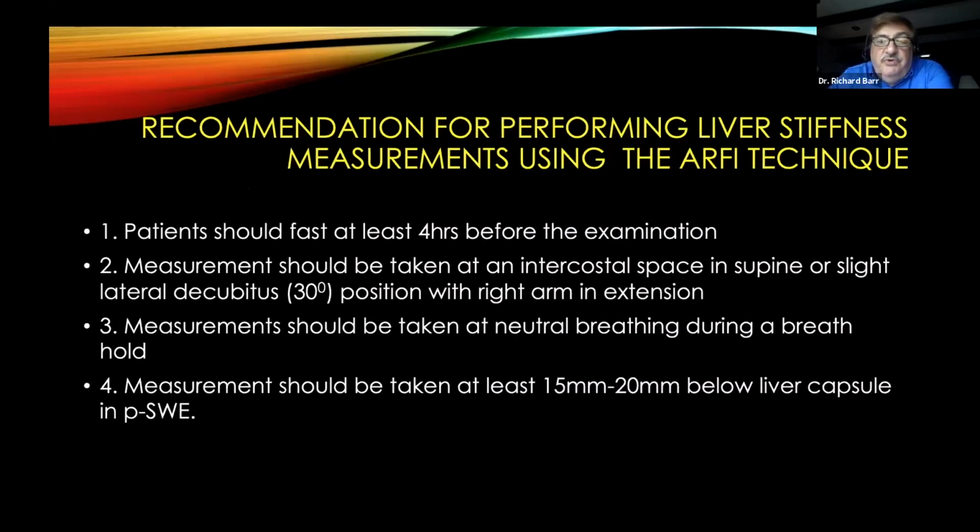Let's just go through the measurements, how to do the measurements, because it's very critical. You have to follow a very strict protocol to get accurate measurements. So one, the patient should fast for at least 4 hours before the examination. And this is because as we eat, we have increased blood flow to the gut, increased blood flow through the portal vein, and the liver actually becomes stiffer.